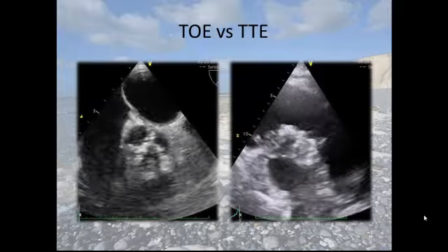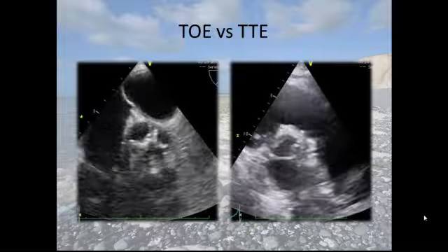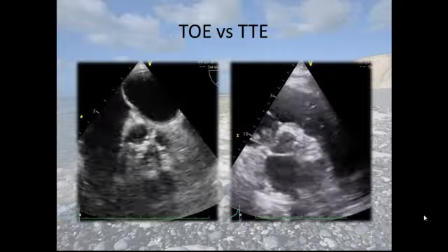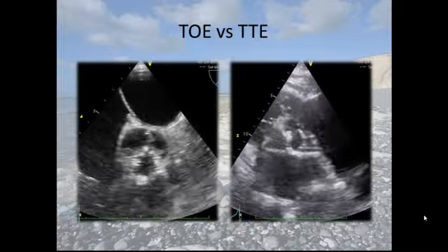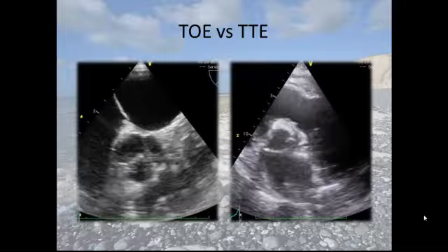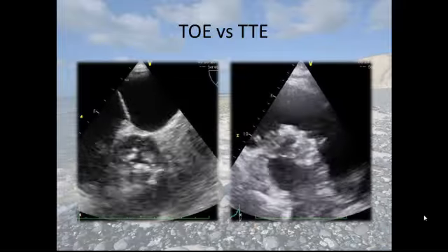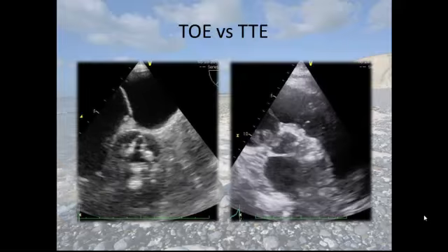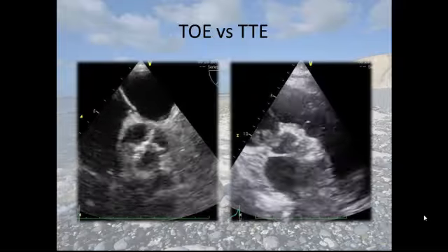On the other hand, the transthoracic echo shows the aortic valve here in reverse, and the pulmonary valve you can see, it's a bit jerky, but hopefully you can see the vegetation whipping around on the pulmonary valve there. And the reasons for these are numerous. Firstly, the probe is sitting much closer to the right-sided structures. And secondly, these patients, particularly those that are young and have been intravenous drug abusers, are quite thin and have nice echo windows. And finally, you can get a lot of reflection from the central bodies of the heart, such as the aortic valve, which can obscure the structures beneath.